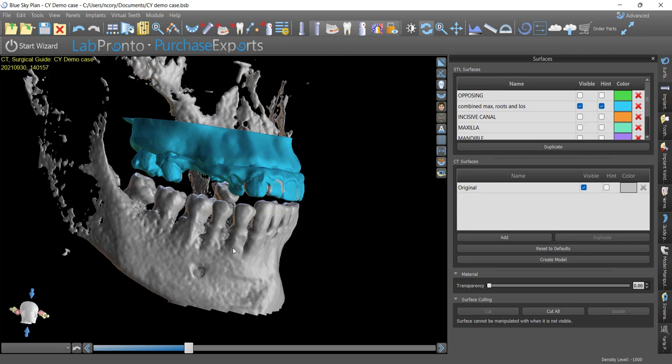Often we just get in the default mindset of having them bite on the bite fork, and then we'll stitch all the stuff later. Well, that creates a lot of problems — what do you build your opposing occlusion to? Especially in dual arch cases, it's incredibly important. Try to get them in the VDO where you want. You can do simple checks with calipers, opening them up with the leaf gauge until they're at the right VDO based on facial proportions, then stick some wax between their teeth and let them bite down and hold in that position during the CT scan. If you'll do that, I promise it's going to save you a ton of time.